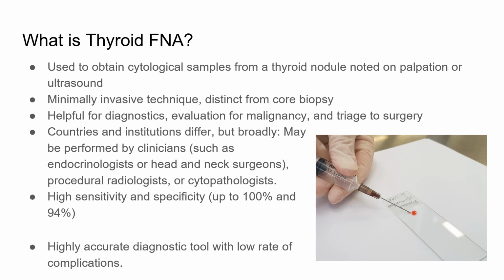Many countries and institutions do it differently, but most broadly, this technique can be performed by clinicians like endocrinologists or head and neck surgeons, or procedural radiologists or cytopathologists. I actually had the opportunity to see it done by both procedural radiologists and a cytopathologist, and the techniques that are used are very similar but interestingly different. So if you have the opportunity to see that, I would recommend it.